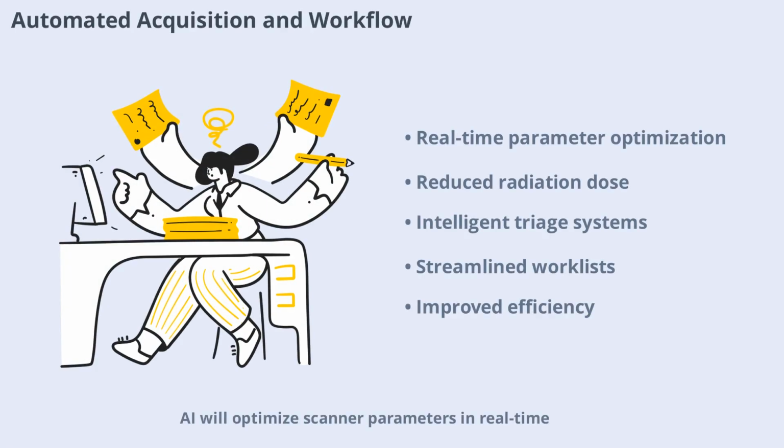AI will optimize scanner parameters in real time, reducing radiation dose while maintaining image quality. Intelligent triage systems will prioritize critical cases, streamlining radiology work lists and improving workflow efficiency. Automated acquisition and workflow optimization are key to maximizing the benefits of AI in clinical practice.